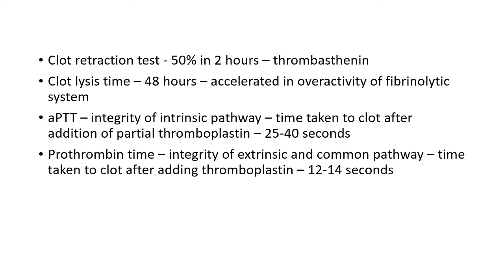Coming to activated partial thromboplastin time, this test measures the integrity of the intrinsic pathway. It is the time taken for the patient's plasma to clot after addition of partial thromboplastin. This addition activates the intrinsic pathway and allows the sample to clot. A normal activated partial thromboplastin time is 25 to 40 seconds. Any prolongation indicates deficiency of intrinsic pathway factors like factor 12, factor 11, factor 9 and factor 8.